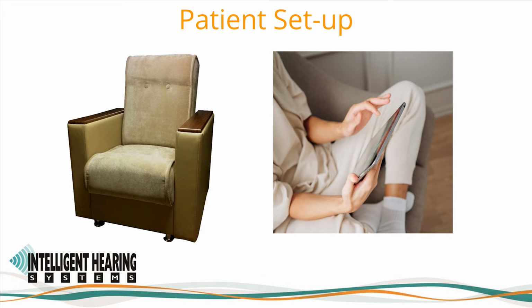Patients should be tested seated or lying down on non-conductive surfaces or recliners. Patient state is important and should be as controlled as possible. CAEP testing should be performed in awake patients. For awake patients, a silent movie can be played on a tablet-like device, preferably mounted on a wall or stand away from the patient. Patients are asked to refrain from any head or body movements and to minimize eye blinks.